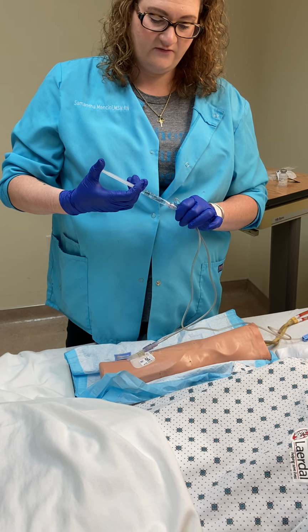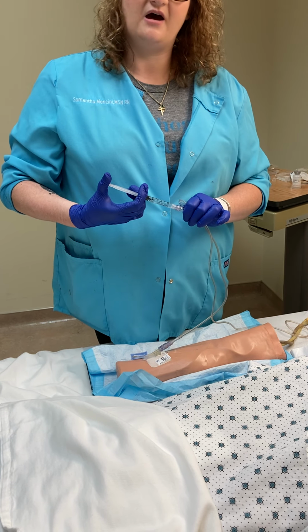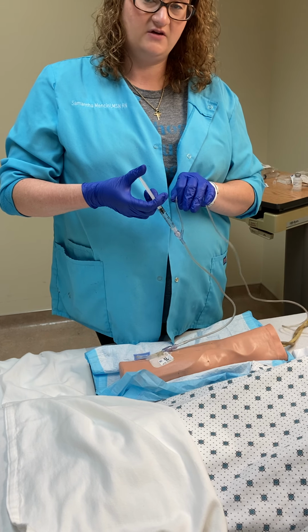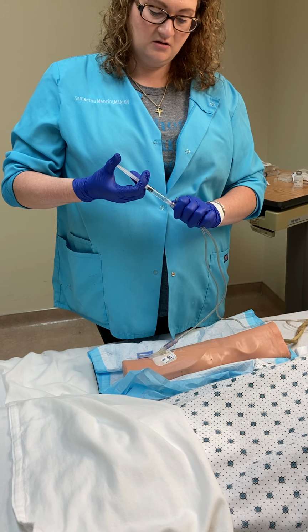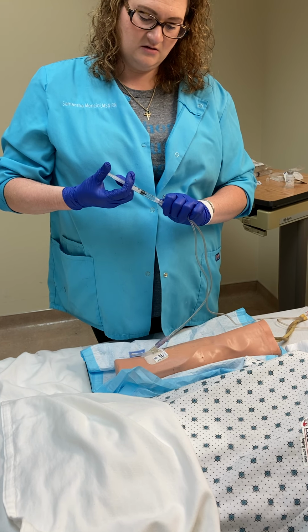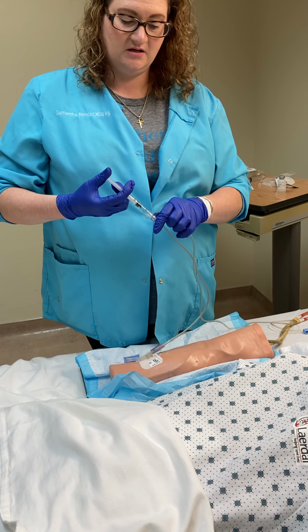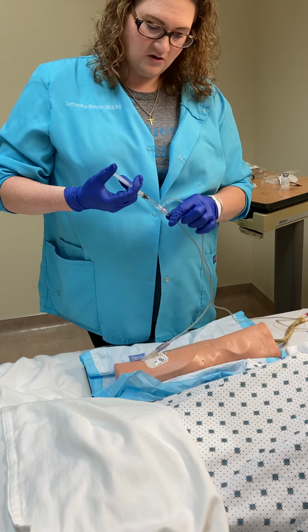So for the first 15 seconds, I am going to push a 0.5 milliliter. And then I'm going to release it to allow the IV fluid to flush it through. I'm going to crimp it again, push another 0.5 ml over 15 seconds. And the pump will beep because it's sensing that the line is occluded. So just be aware of that. When I unpinch it, it'll usually go through.